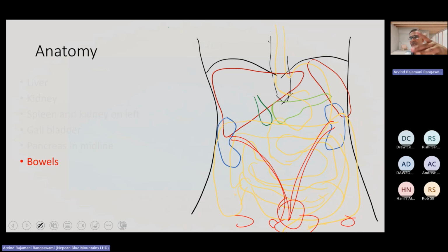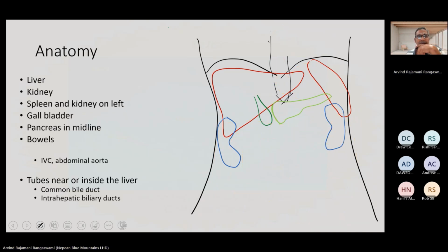The reason I haven't drawn those is mainly because I think the genitourinary tract is something we are interested in as clinicians, as critical care physicians. However, we don't often look at the adnexal system in the pelvis, but there's no reason why you cannot do it. It's so easy, so intuitive. Okay.